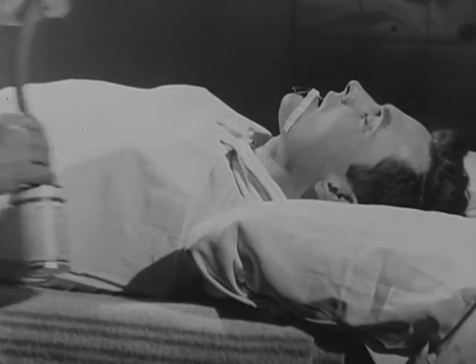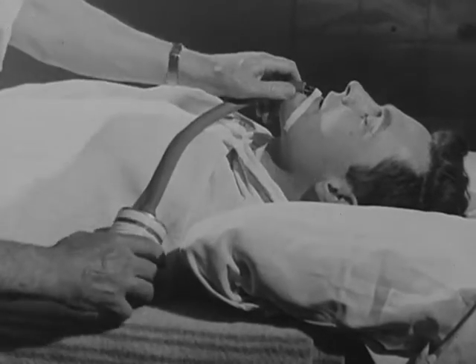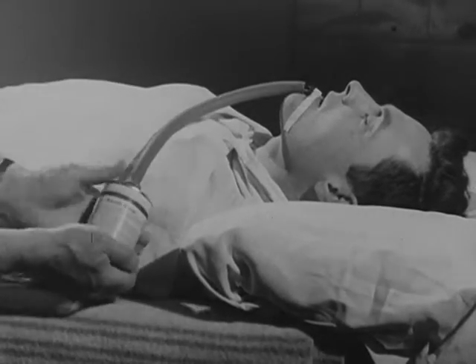When no machine is available, Flagg's method of attaching a length of rubber tubing to an ether can is a useful improvisation in emergencies.